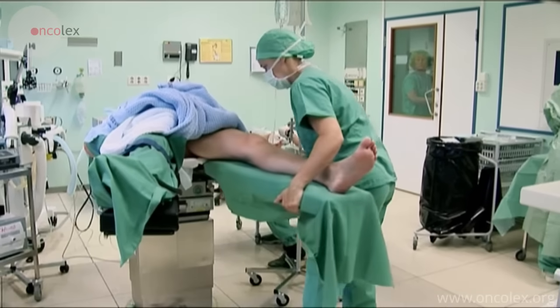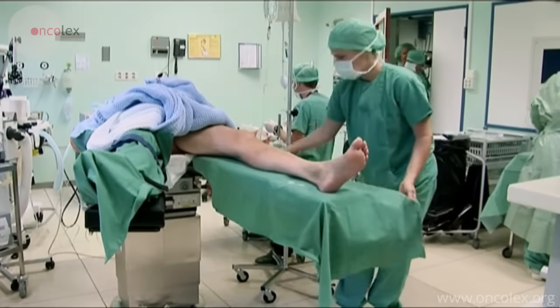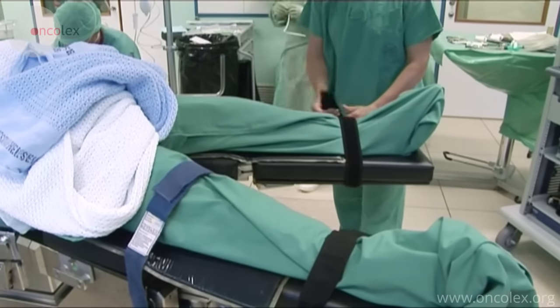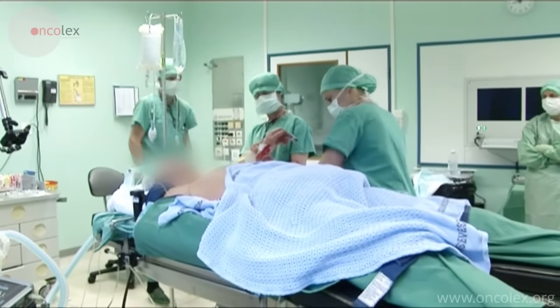This is a video of a robot-assisted radical prostatectomy. Before the operation begins, a nurse prepares the patient by wrapping the patient's legs and fixing them with straps.